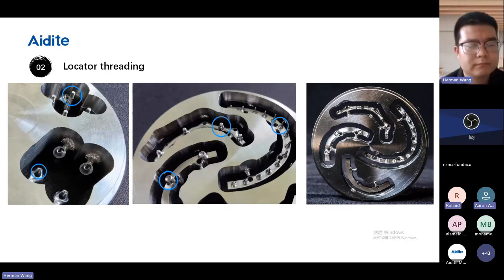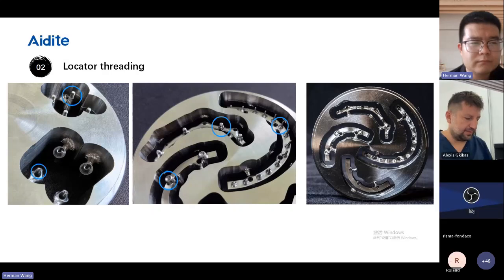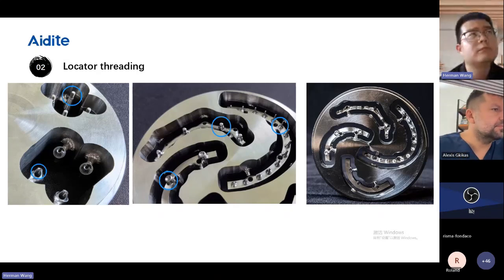Okay, is this similar to AMM-520? We just put the filtering system on the machine and then close the dry mill suction unit, then connect to the wet mill filtering system and start milling for the wet mill materials. Is it similar to AMM-520?